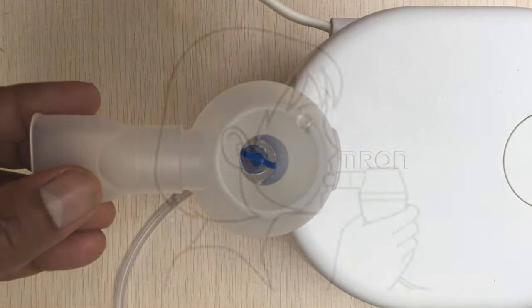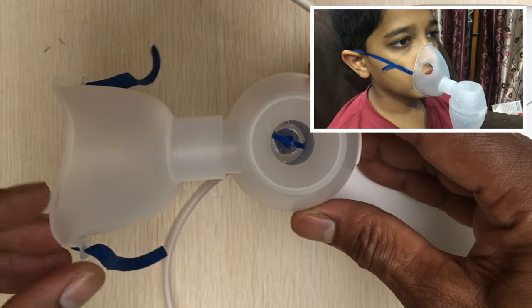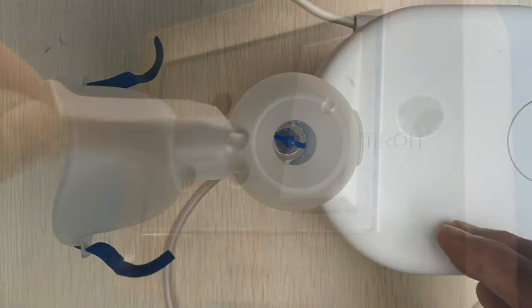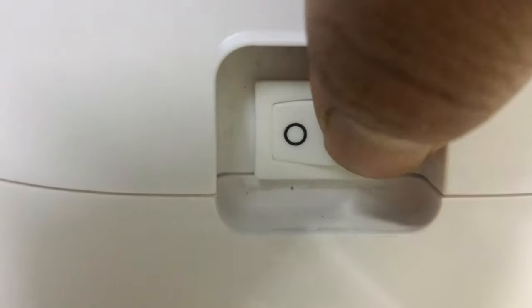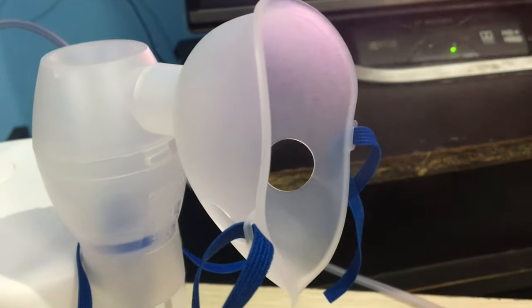Attach the other end of the tube to the compressor firmly. Attach the mouthpiece if the inhalation is from the mouth, or attach the mask if the inhalation is from the nose. Switch on the compressor. You can see nebulization begins and aerosol is generated.